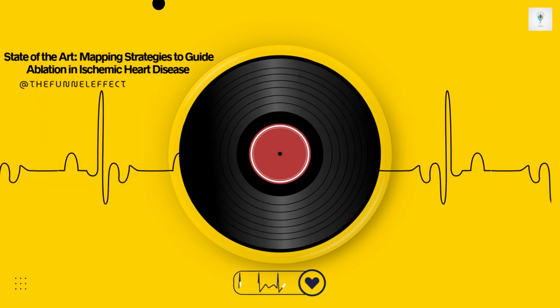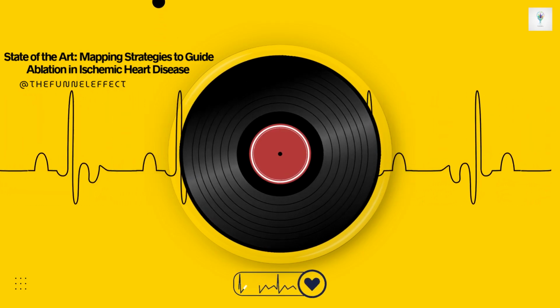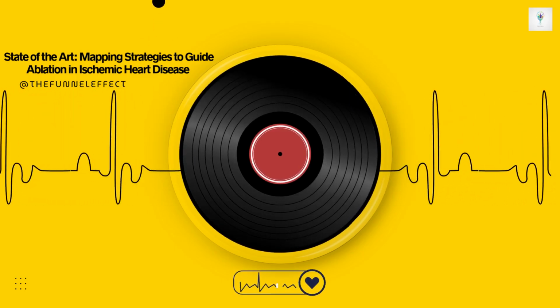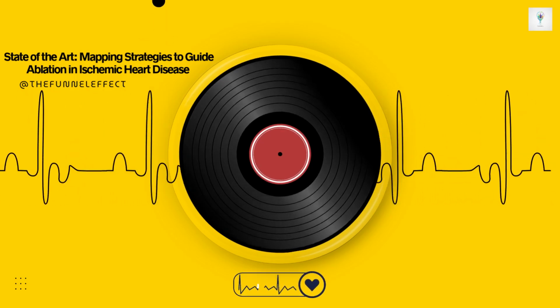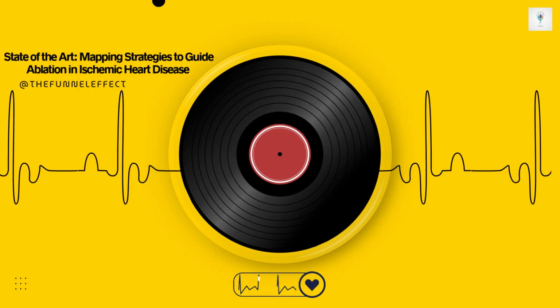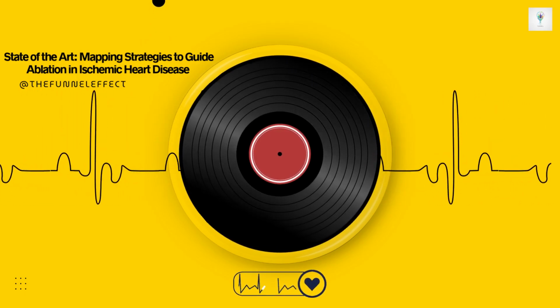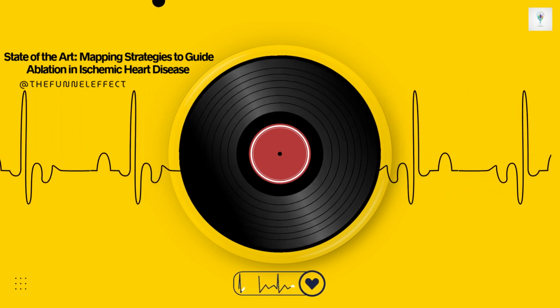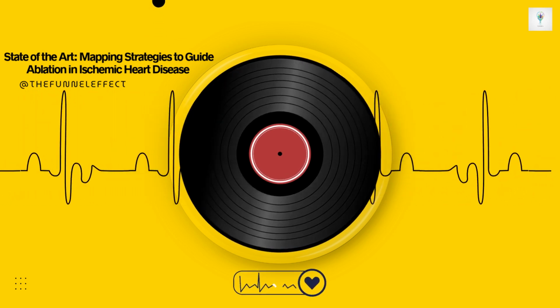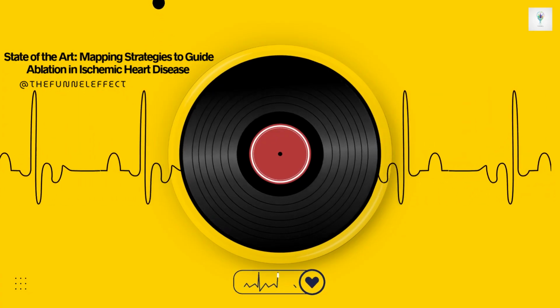Okay, so voltage gives us the broad geography, but we need more specific landmarks within that territory. Let's talk about specific electrical signals. Late potentials, LPs, and fractionation. Right. LPs are kind of the classic sign of slow conduction during stable rhythm. These are electrical signals, little wiggles on the EGM tracing, that occur after the main QRS complex is completely finished, during the time when the ventricles should be electrically quiet. Late signals, suggesting something is lagging behind.